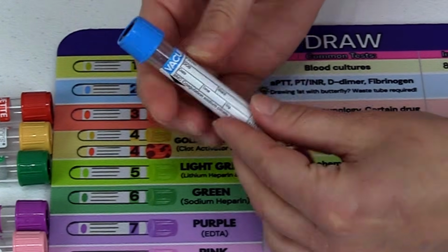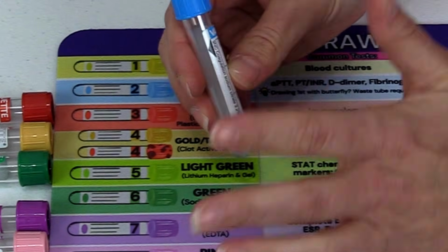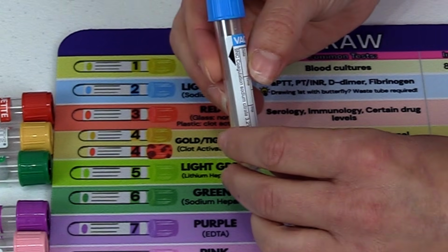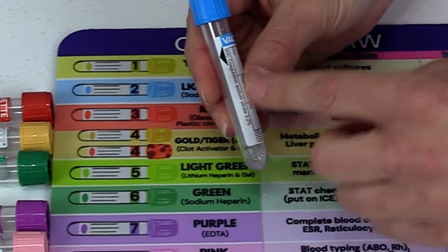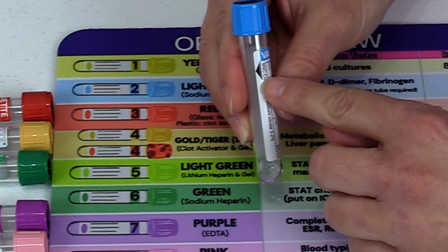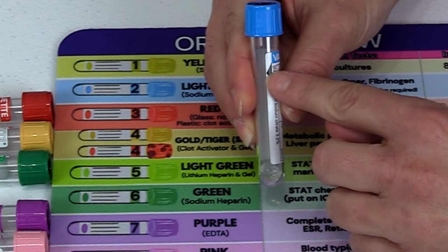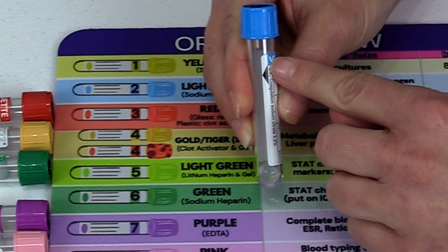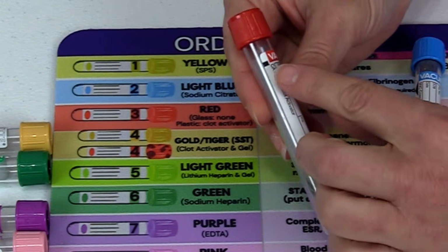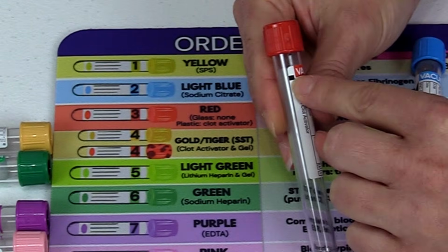So on your tubes, along with that, you're also going to have a fill zone or fill mark. This right here is the sodium citrate. It has a specific blood to additive ratio, so it's really specific in how much you need to fill it. It will have this arrow to help guide you. Like the bottom of the arrow will be the minimum mark, the middle is the mid mark, and then the top is the maximum mark. The other ones will have like a little black square, and this is your fill zone for that.